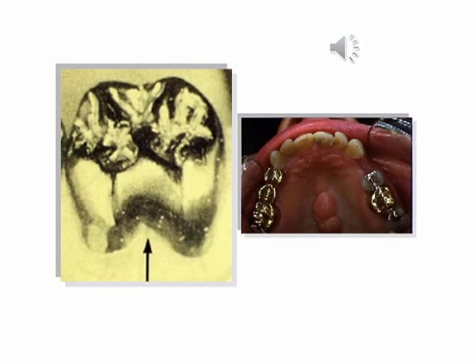The complete cast restoration. Advantages of the complete cast restoration include excellent longevity and strength. They may be adapted to better facilitate hygiene, for example, as seen in the illustration of a tooth with margins in the furcation area. Disadvantages. The complete cast restoration may present an objectionable display of metal.